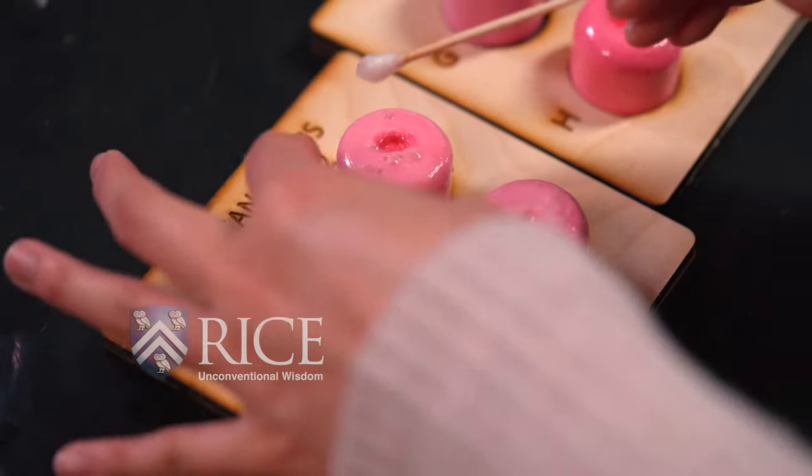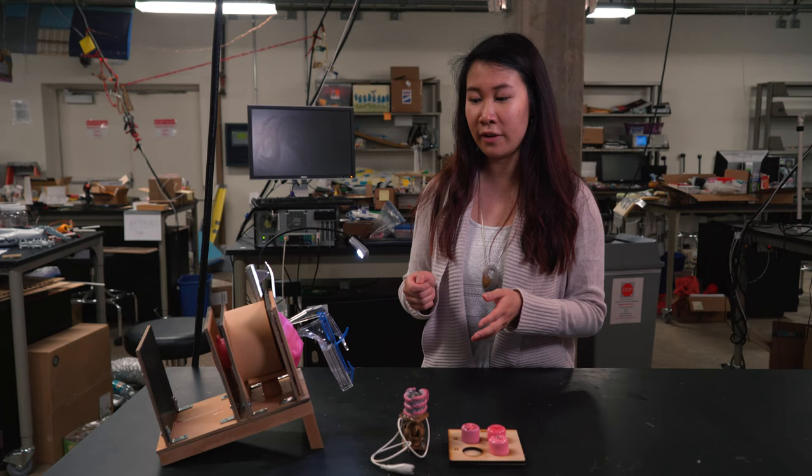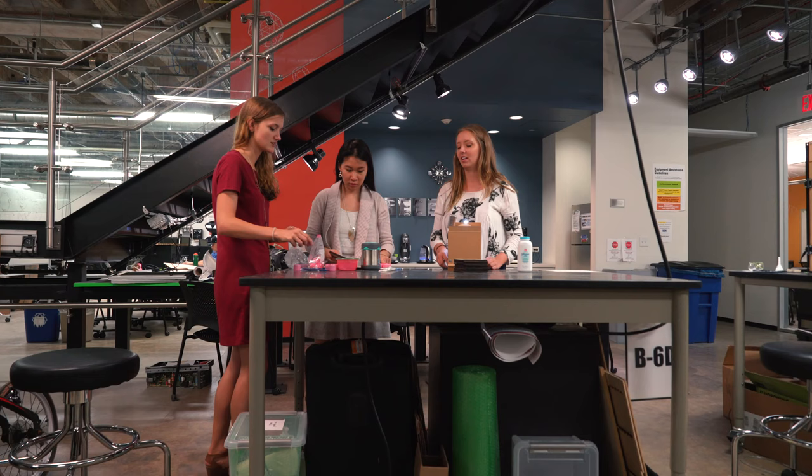One of the procedures that this model trains is VIA, which means that when you swab a cervix with vinegar, if there are cancerous or precancerous lesions, they will turn white.